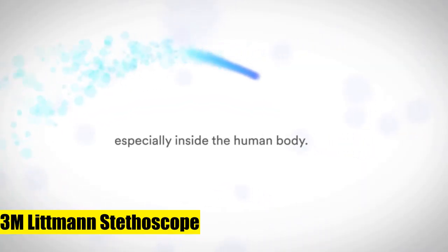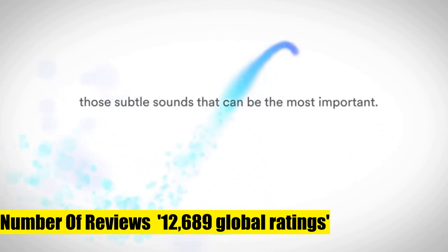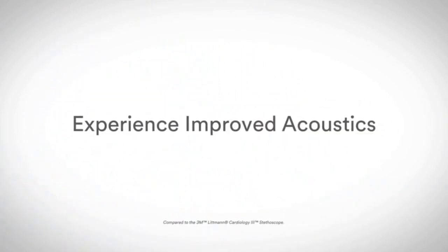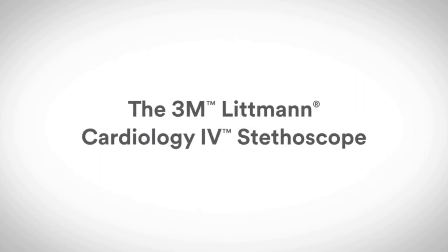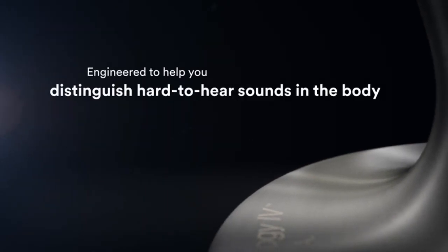3M Littmann Stethoscope, Cardiology 4, Black Tube, Black Chest Piece, 27-inch. Diagnose and make decisions with confidence; hear subtle changes in patient status. Useful in critical care and challenging environments such as the ED, ICU, cardiac ICU, step-down unit, and other dynamic locations. 7-year warranty.